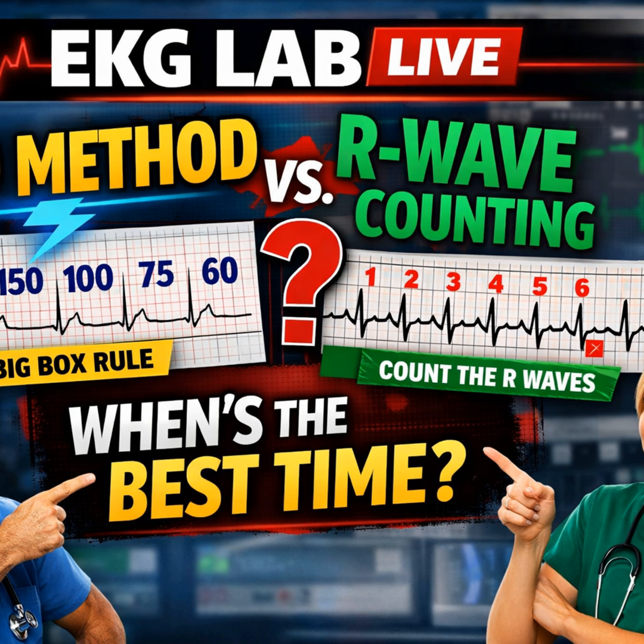Sure, and you use the small boxes for that. Exactly. You are already in the grid. You're already counting small boxes to measure QRS width. So if you're already looking at the grid to measure width, why would you suddenly pull back and just count spikes to measure rate? It breaks the workflow. It suggests you don't trust your ability to interpret the timescale of the paper. Using the big box method for rate is just the natural extension of a thorough analytical exam.